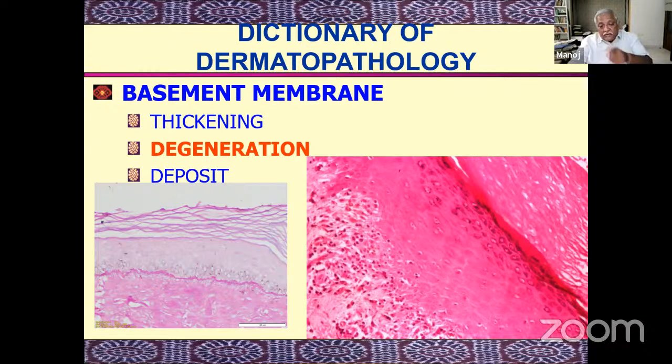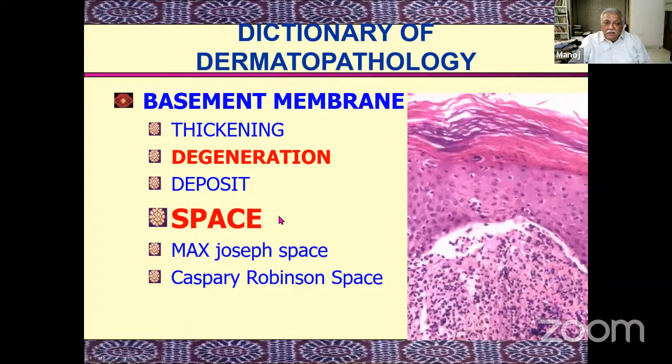So, for example, here in this particular case, where you have a lot of inflammation here. So, there is inflammation, inflammatory cytokines are there, and the dermis here is not able to perform its usual function of forming the basement membrane. The basement membrane appears deficient. Can you make out that? This is a special stain for the basement membrane. This is a relatively normal basement membrane. It's not there here at all because something is going on here. And again, the same thing. You have a lot of inflammation here. So the basement membrane is not being able to be formed here.